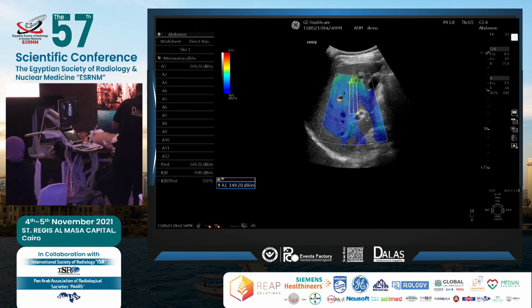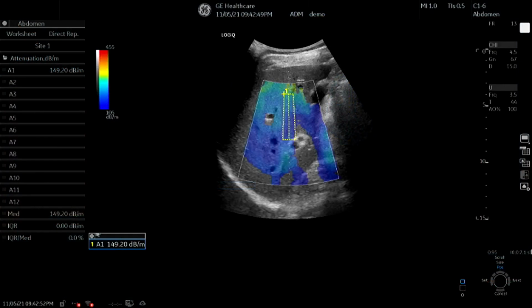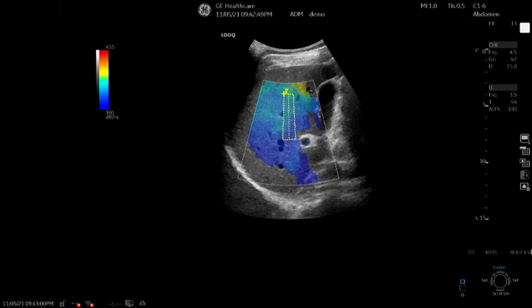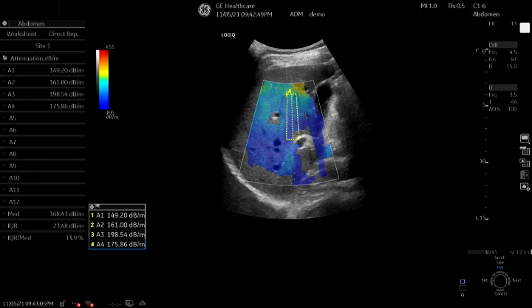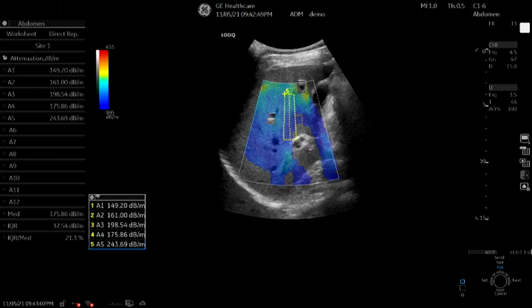Breathe. He was breathing during the scan, but we can see how we will avoid this. So in the first shot, it was quality high. I can accept and move to the next. Same story here. I need to move the box a little bit to the right. Again here. So I managed to do the whole 5 shots quickly, following the right technique and moving forward. I can do more, but as long as the 5 are consistent, we can go ahead.